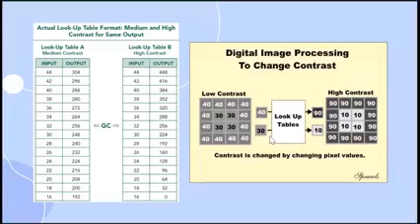So as you can see here, this is the role of the lookup table. So from low contrast, then after that processing through the use of lookup tables, if you want to create a high contrast image, ganito na ang kanyang pixel values. Okay, so from 40, which is a shade of gray na lower than 90, and then si 30 naging 10, which will produce a high contrast image na siya because the contrast is now high. So there, it is more on the black and white na picture, compared to a low contrast one, which has gray, which is a gray color.